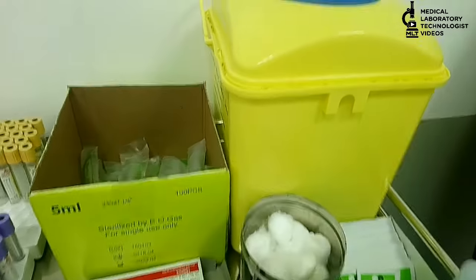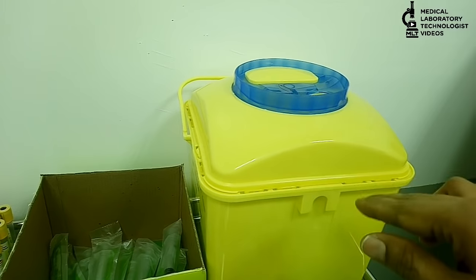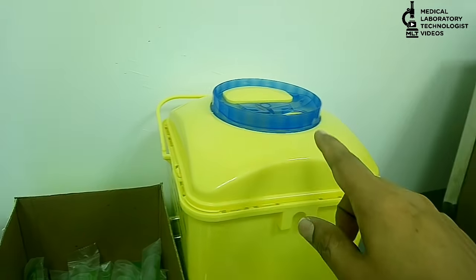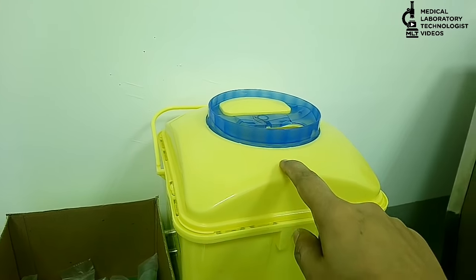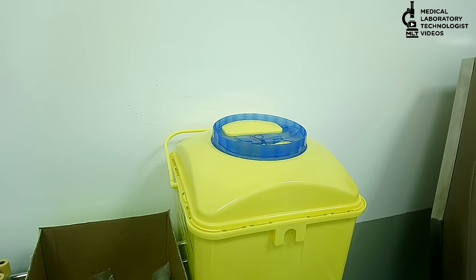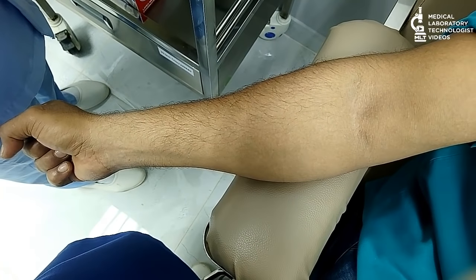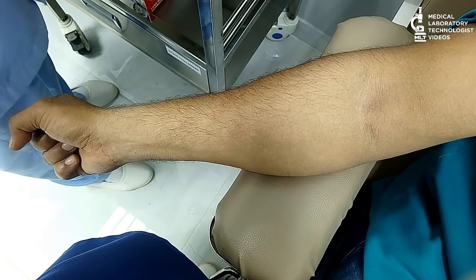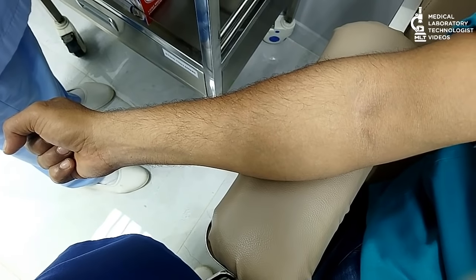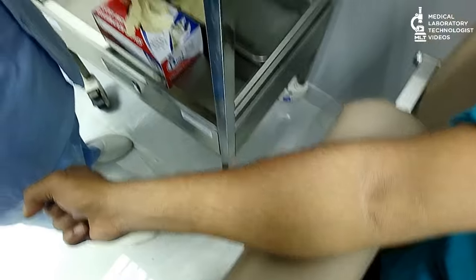After extraction, you have to properly discard the syringes. You can discard the syringes into the sharps container. After extraction, do not recap the needles. Now, we have to take the bottle and attach the barcode on the bottle.